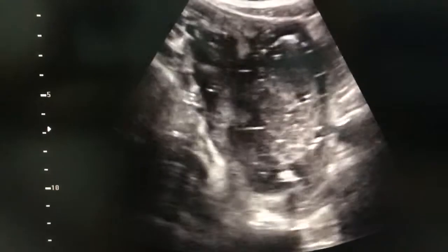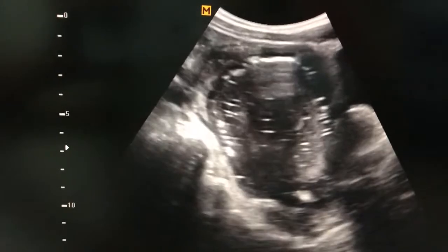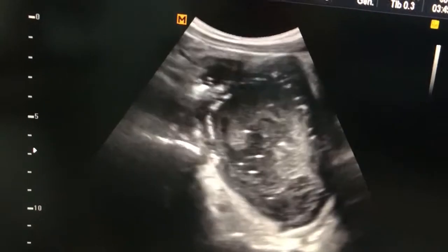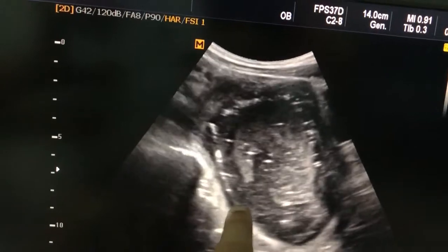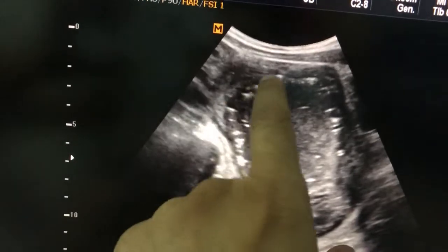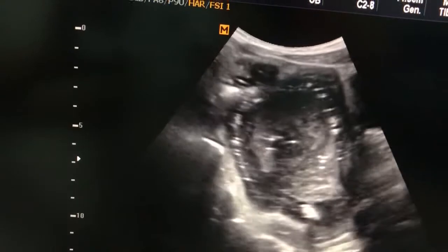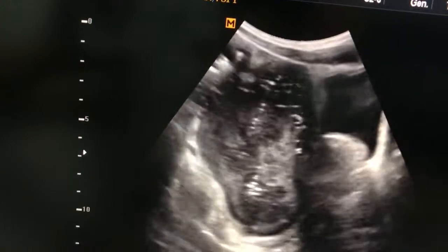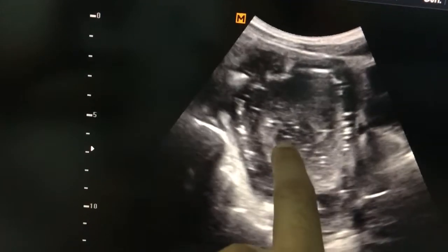This is a 16-year-old patient, and the probe is placed on the right iliac fossa. What we see here is some hypoechoic mass lesion having a peripheral calcified margin and internal horizontal hyperechoic foci.